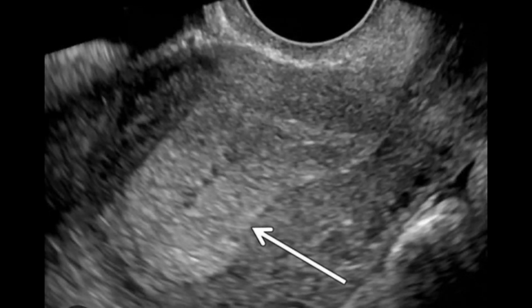As far as polyposis is concerned, it is not likely because the homogeneity is quite uniform, so a polyp presentation may not be likely. As far as incomplete abortion is concerned, you can't consider that either, because in incomplete abortion there may likely be some other associated changes.